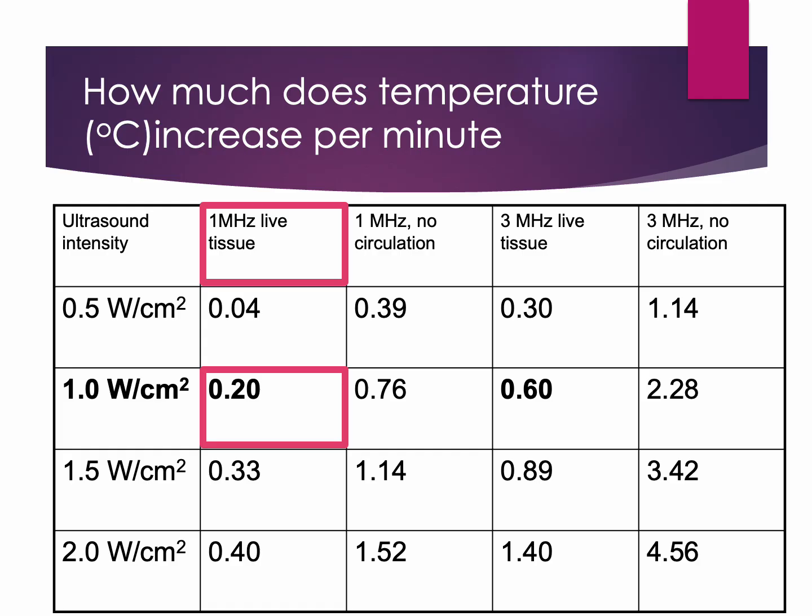If the math is difficult, think every minute it increases 0.2 degrees. So in 5 minutes, it would increase 1 degree, and in 15 minutes, it would increase the 3 degrees needed.